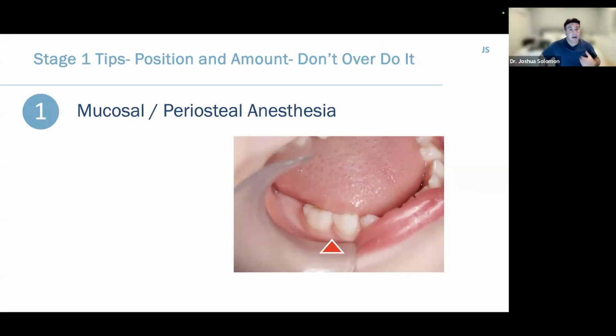Okay. So, number one of the main reasons someone is interested in tips to make kids more comfortable, this is it. If you think about that papillary triangle as a triangle, the goal is to deliver that bolus of local anesthetic just in the center of that triangle.